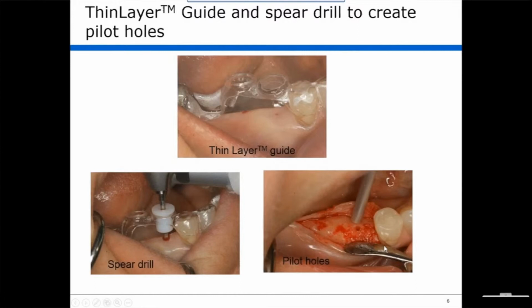Here's your bleeding point. So the implant trajectory is defined, instead of being defined by the top and the bottom of the tube, the trajectory is defined by the guide tube, the guide hole here, and that's exactly the same position and height as the top of the steel tube or the metal tube that you saw, and this bleeding point here.